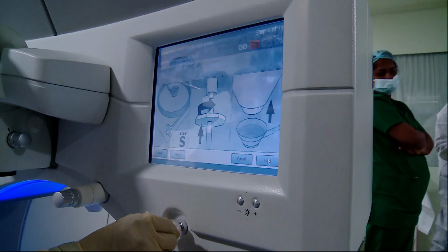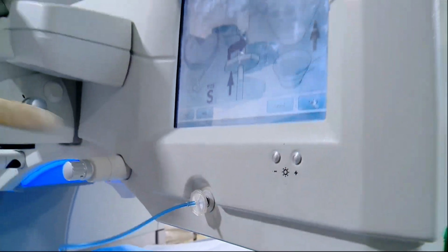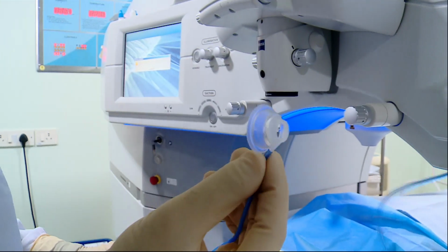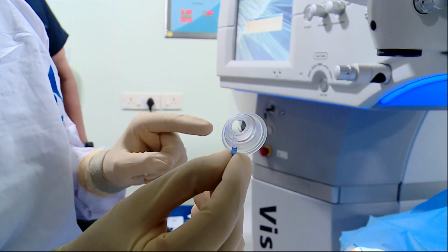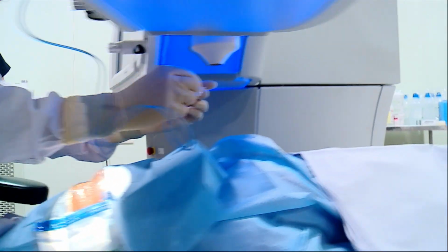Okay, so this we are adding on to the suction. Can you see this? This has been added on to the suction. This is the patient interface, as you can see. So, look here. Focus on this. This is the patient interface which is at the limbus.